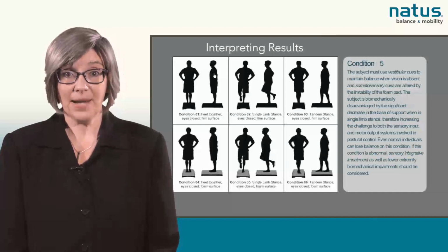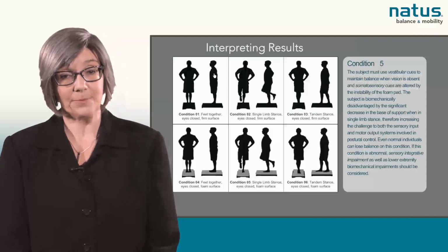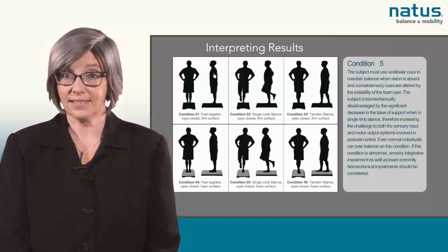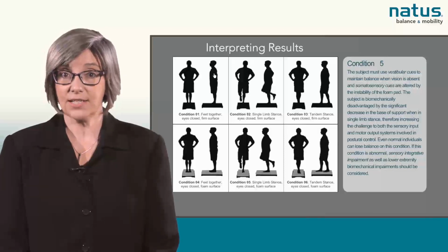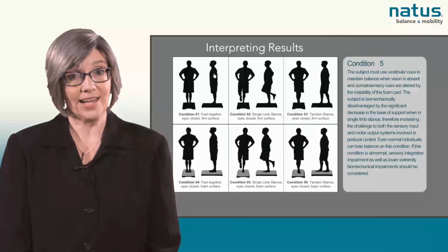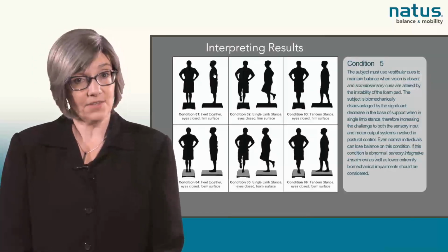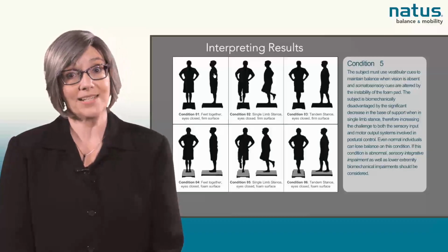During condition 5, the patient is tested on the foam pad in single limb stance on the non-dominant leg. The hands are on the hips and the eyes are closed. The patient must use vestibular cues to maintain balance when vision is absent. Somatosensory cues are altered by the instability of the foam pad. The patient is biomechanically disadvantaged by the significant decrease in the base of support when in single limb stance, therefore increasing the challenge to both the sensory input and motor output systems involved in postural control. Even normal individuals can lose balance on this condition. If the condition is abnormal, sensory integrative impairment as well as lower extremity biomechanical impairments should be considered.